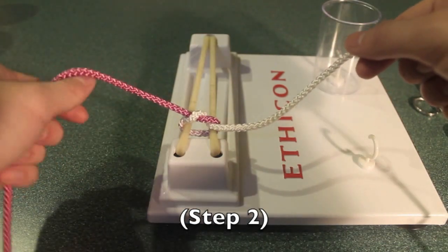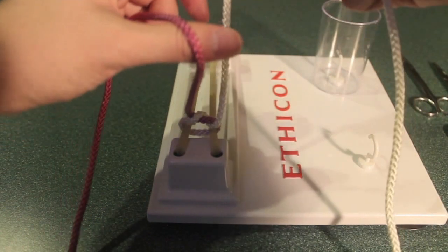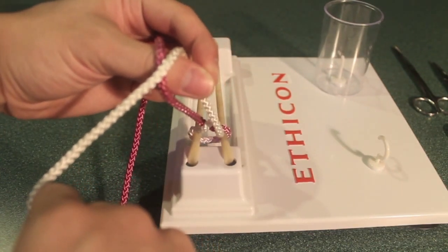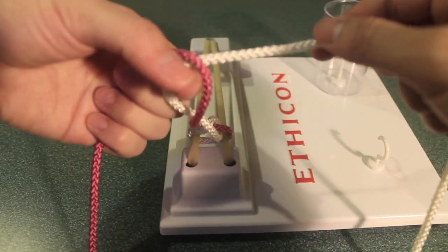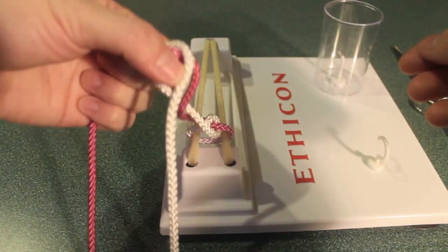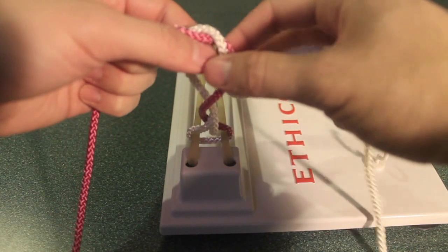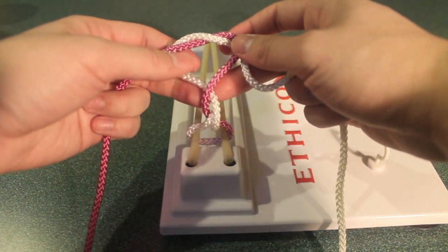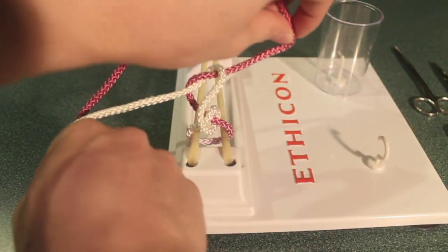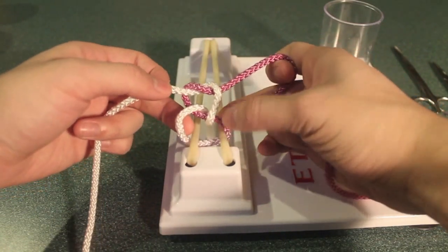The second step is sort of an inverse to the first step. With our left thumb, place tension on the suture and create a loop over the thumb. Connect our thumb and forefinger in the left hand and pass those through the loop towards ourself. Then slip the free end of the suture in our right hand into those fingers and pass it through the loop away from yourself, presenting that to the right hand. The loop we've just created has a cross in it, which indicates that we need to cross our hands for the second step while pulling horizontal in order to lie the knot flat. Once we've done that, we've created our square knot with one twist on the bottom and one twist on the top.